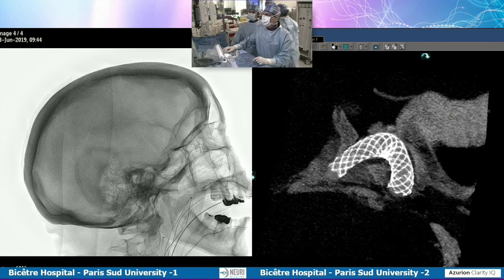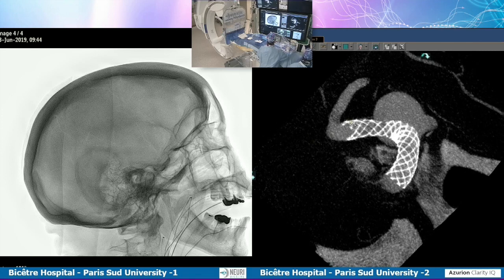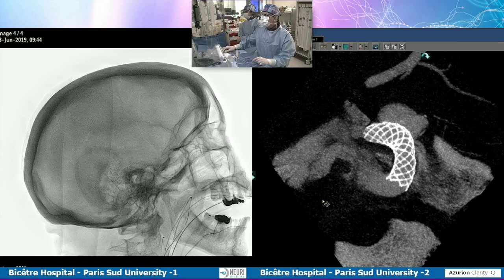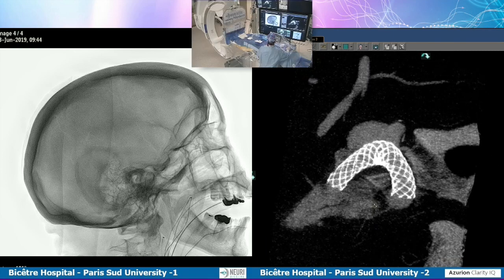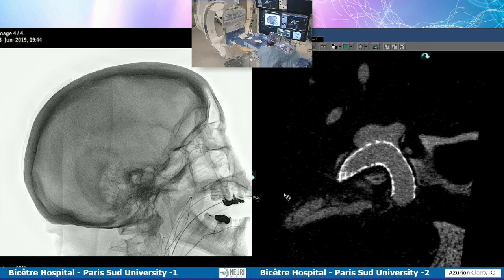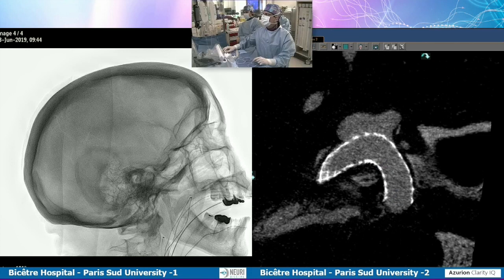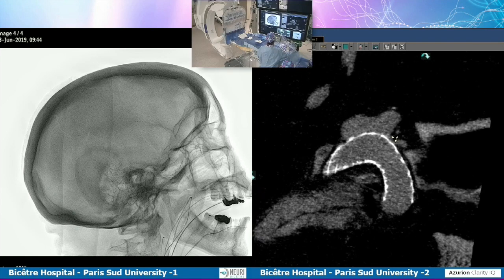So we just double-check that the EVOLVE is properly applied. So this is the distal apposition of the EVOLVE. Of course, there is a compression at the level of the neck. And most important is the apposition at the level of the carotid siphon. So I turn around. I will get a thinner slice. So this is the view. The view, I will go back and forth. Sticking out.